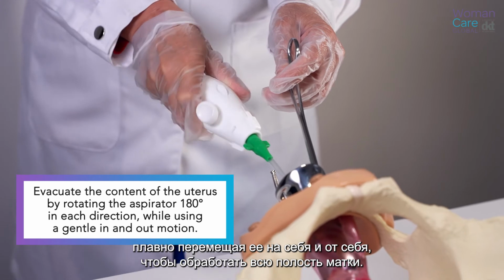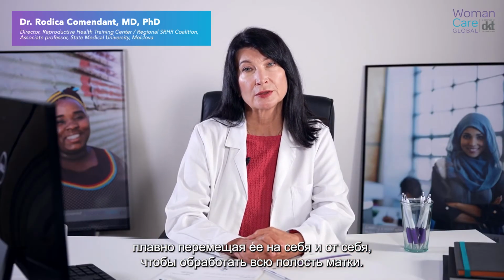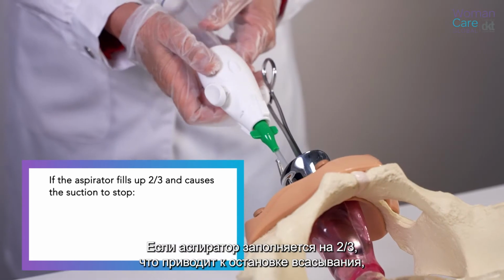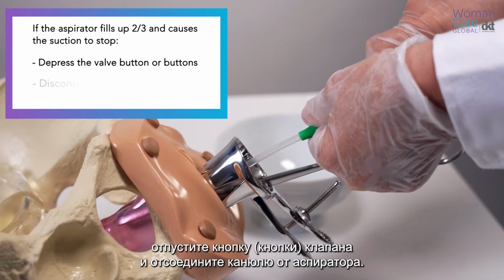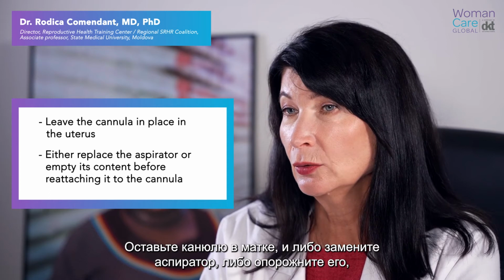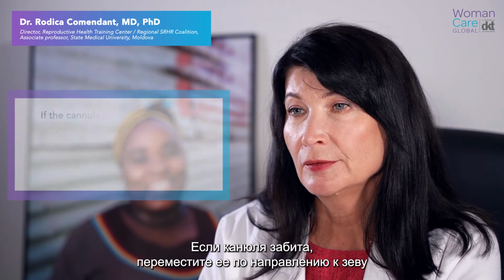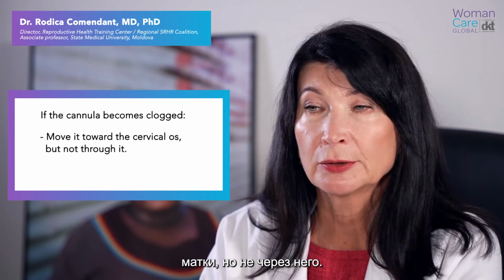While using a gentle in and out motion to cover all the surfaces of the uterine cavity. If the aspirator fills up two-thirds and causes the suction to stop, depress the valve button or buttons and disconnect the cannula from the aspirator. Leave the cannula in place in the uterus and either replace the aspirator or empty its content before reattaching it to the cannula.